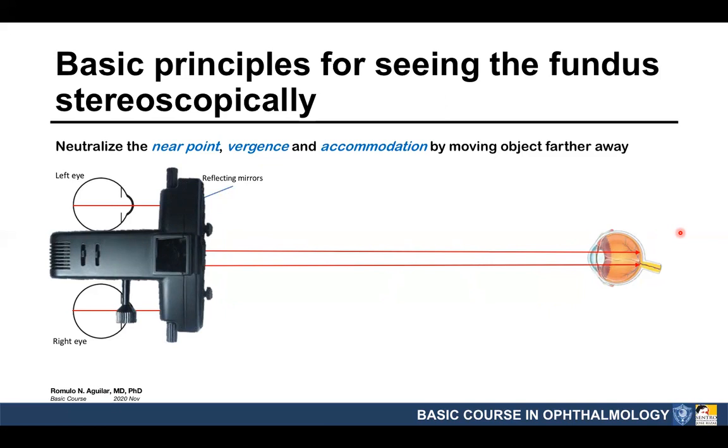And then, of course, there is the requirement of illuminating the internal eye. So you have a light source which would illuminate the eye, and then you have to focus, okay? Because the mechanism or the distance will not allow you to focus very much on the details.